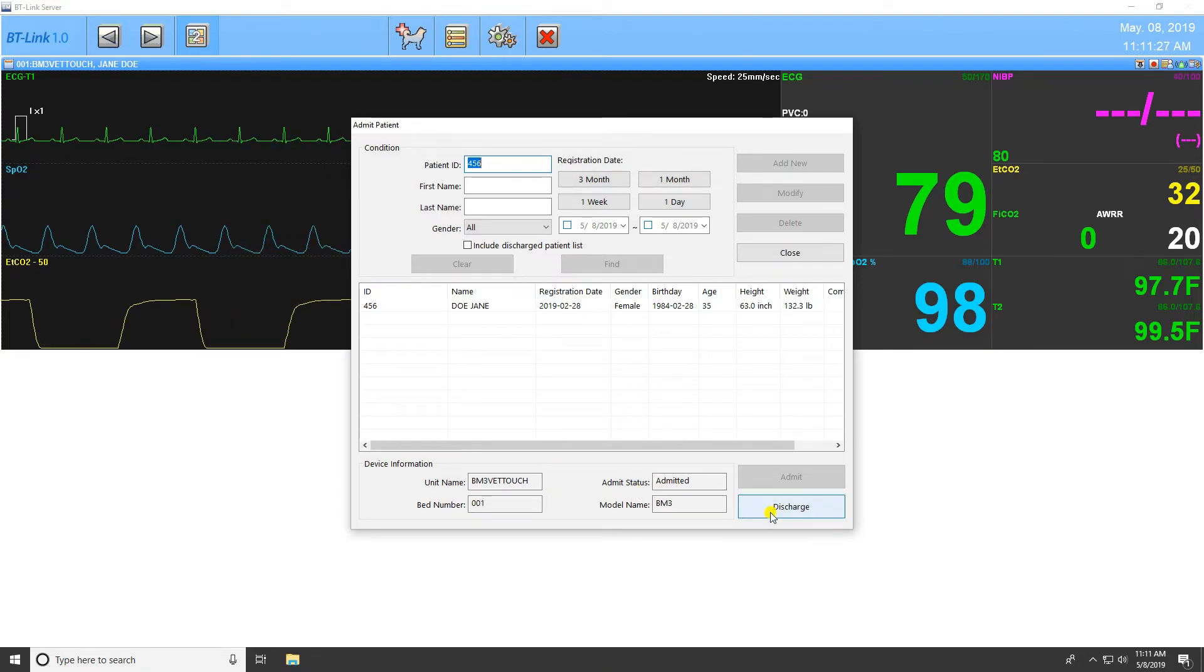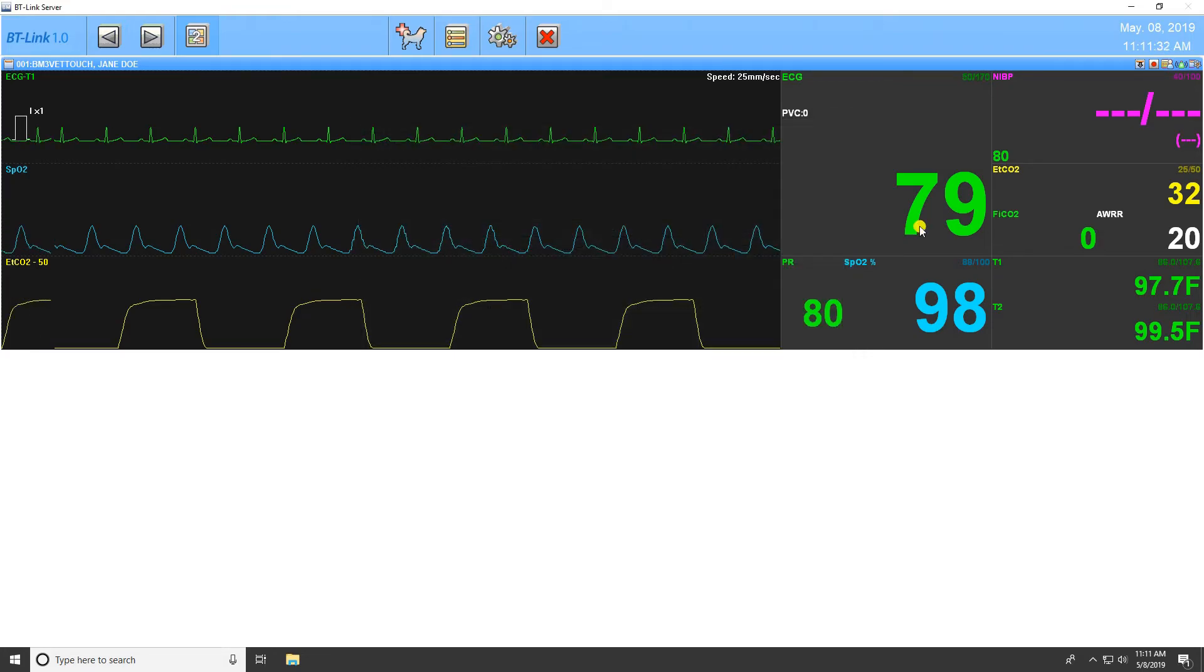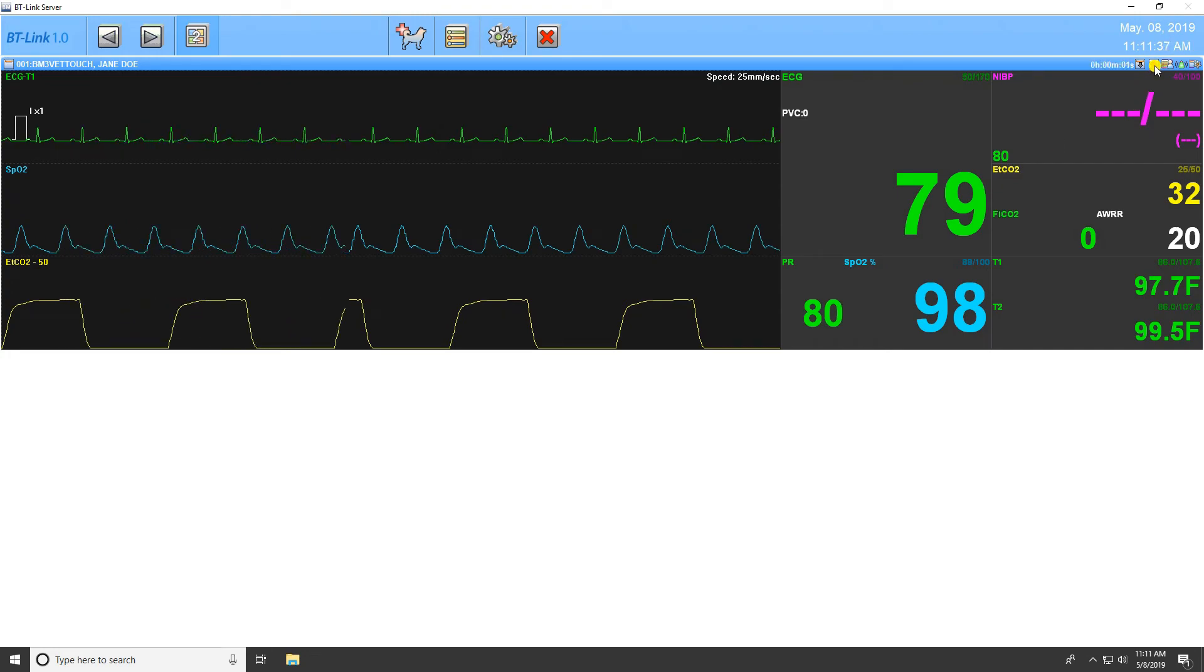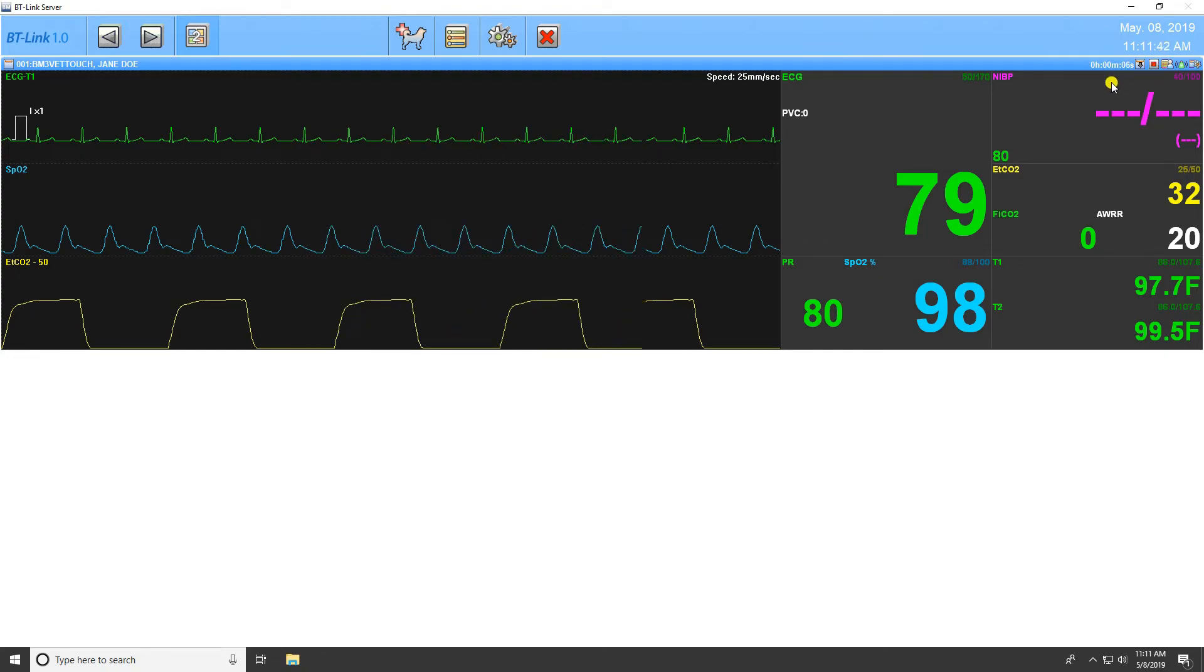Once a patient has been admitted, a new icon for recording patient information will be displayed above the client window. Pressing this button will start recording the data from the monitor, and a time display will appear which demonstrates how long you've been recording. Press the Recording button again, now changed into a Stop icon, to end the recording of patient data.